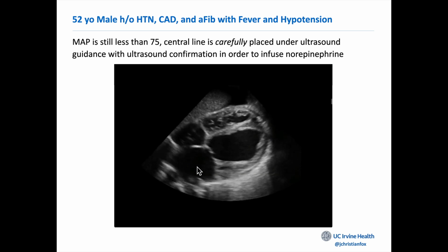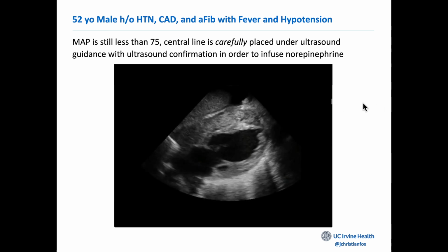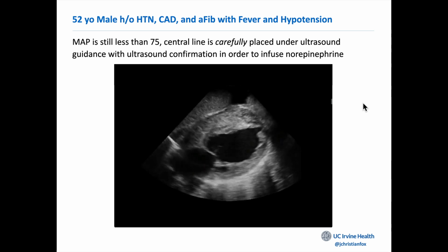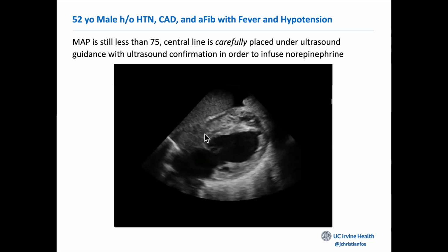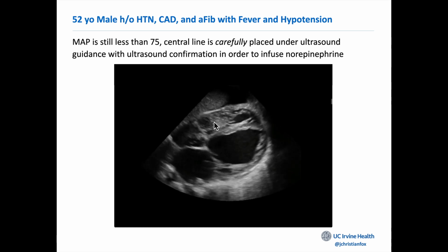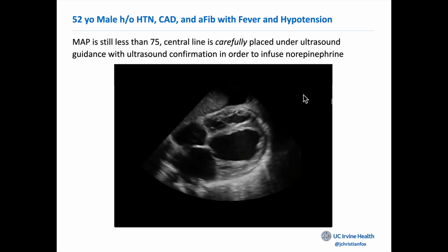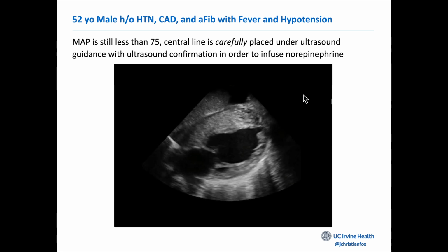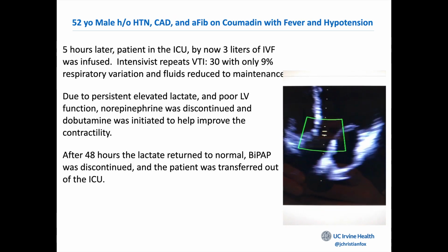And then also we're going to look at the heart, and the right side of the heart has a little blush in it as we give a push of our IV fluids going in there. Maybe there's a bubble or two in the tubing, which is normal. You could agitate some saline if you wanted to, but you don't have to. Even just one or two bubbles will cause all of this blush seen in the right atrium and right ventricle. So we know that we are on the venous side when we place that central line. That confirms we're in the right location, and then we go ahead and start using that central line without the need for a chest x-ray.